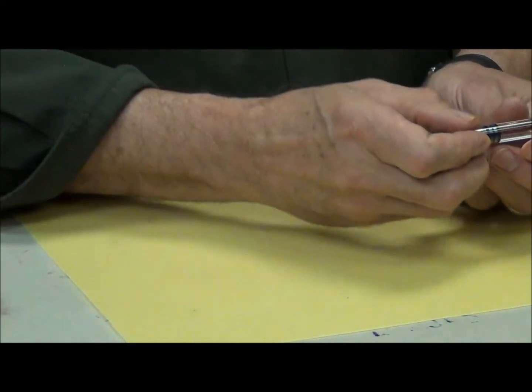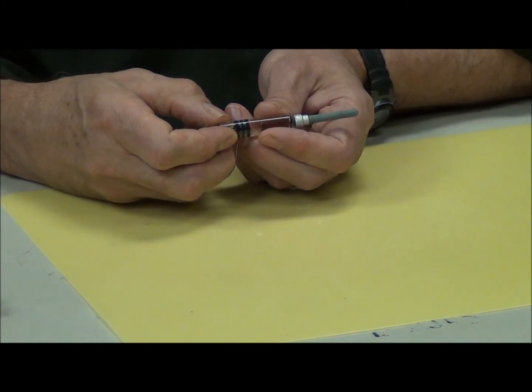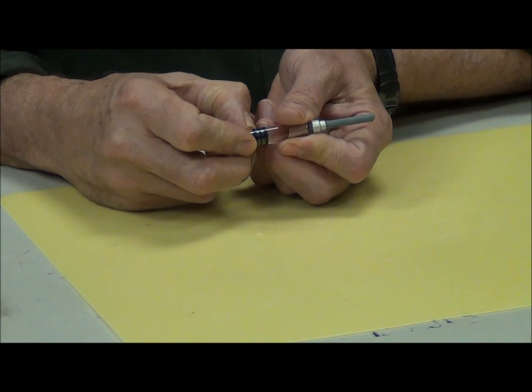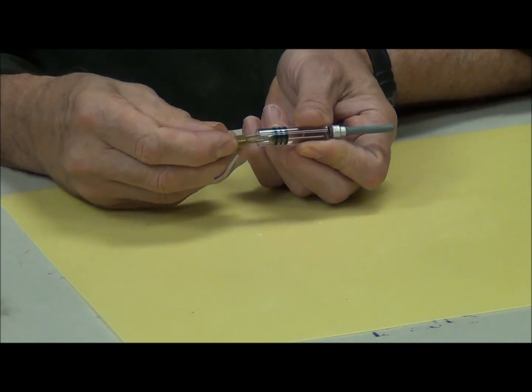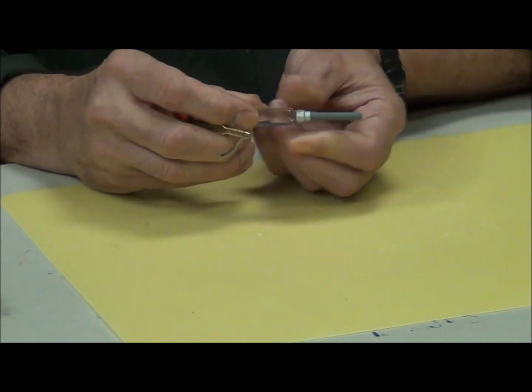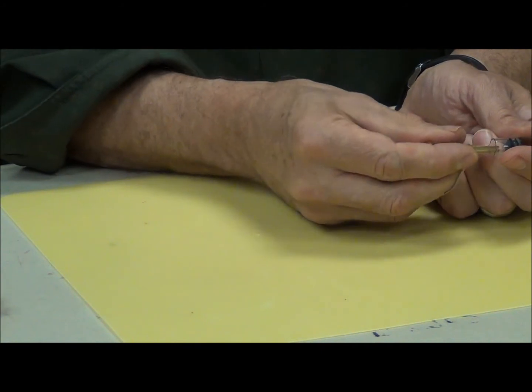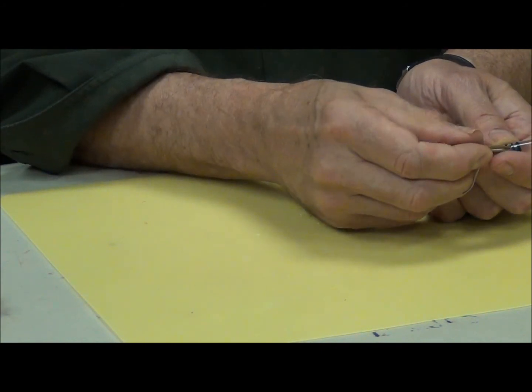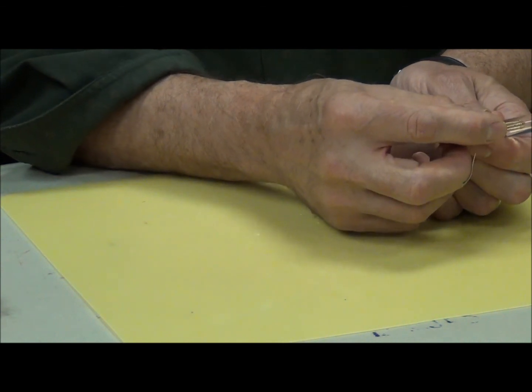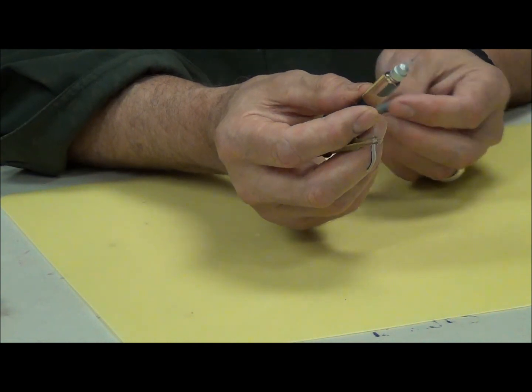We compared an unused carpule to one that had been fired. It's about 3/4 of the length of the black stopper. So if you use this, you could push this down about 3/4 of the length for a second dose. Injecting the needle into the individual, pushing this down until you've drawn almost the complete width of the stopper. There are actually about 3 or 4 additional doses of epinephrine in the old style pen. Now we'll go to the new style pen.